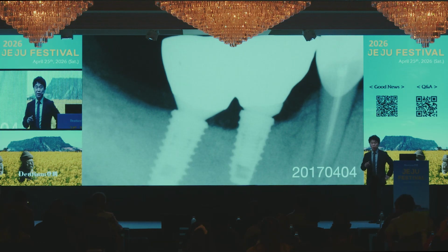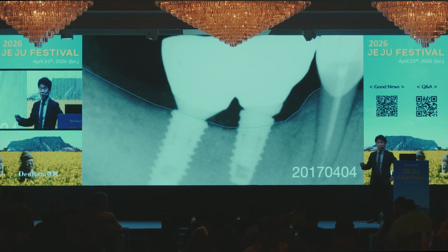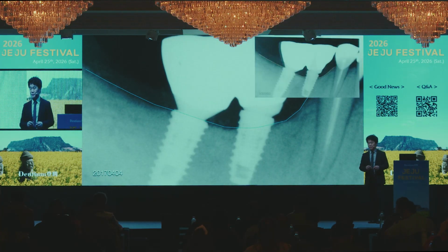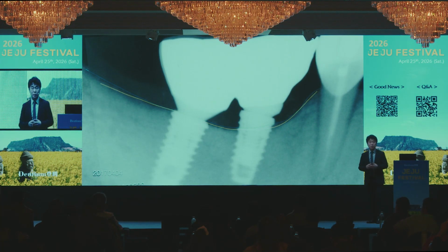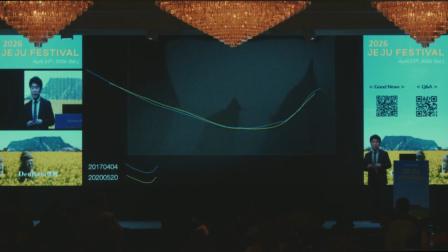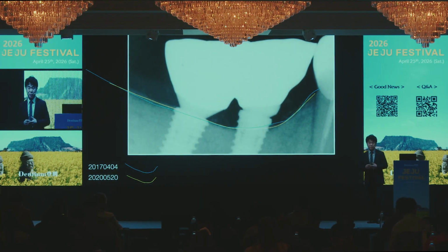But I can get the 3-year radiograph. Also, we can compare the 2 radiographs, such as this. How about that? This marginal bone is quite stable, compared with the previous patient. So these patients can be checked by me or the clinician at regular checkups.